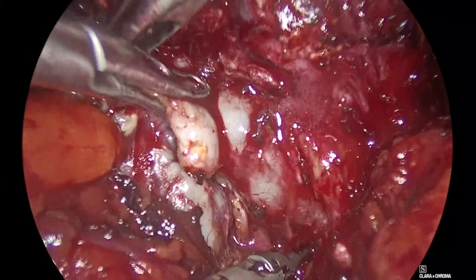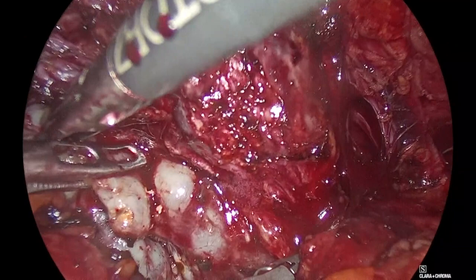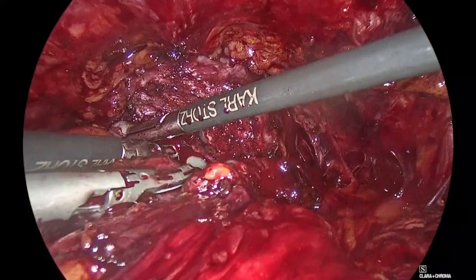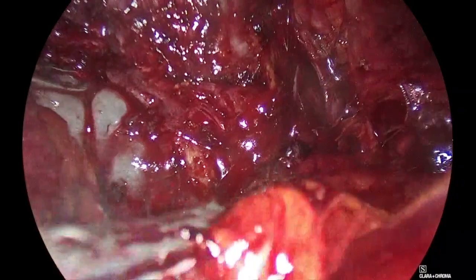Good. Now, in this case, theoretically, we want to do a nerve-sparing procedure. So we normally tend to keep the tips of the seminal vesicles. This is a debate, I know. Go back, Padeli. Suction here on the side, Panagiotis. Come in, Padeli. We are still very high up for the pedicle here, eh? Good. Show me, Panagiotis. Grasp this, please.